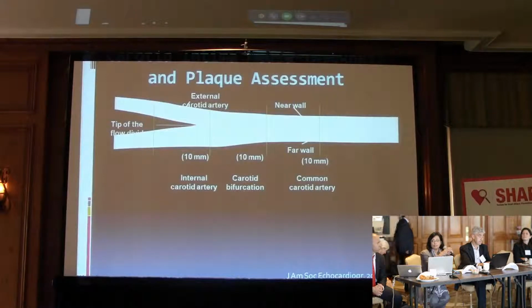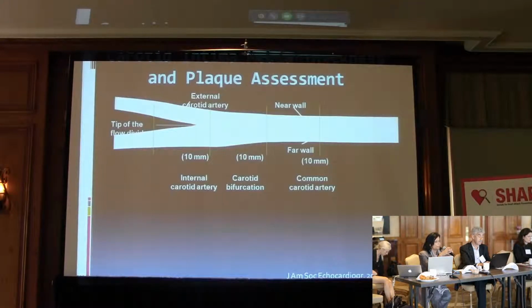So that's the springboard for my discussion on carotid IMT and plaque assessment. I'm actually going to touch more on the conventional studies that have been done in carotid IMT and plaque. And Henrique is going to talk more about the more recent developments in plaque, including three-dimensional plaque imaging that he's been involved with in the HRP project.